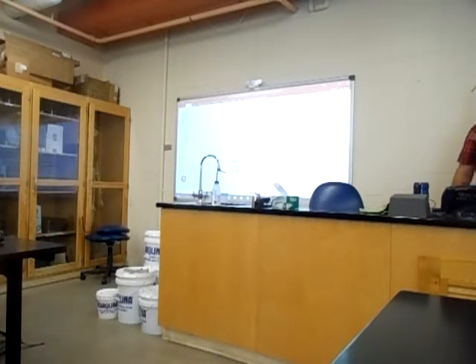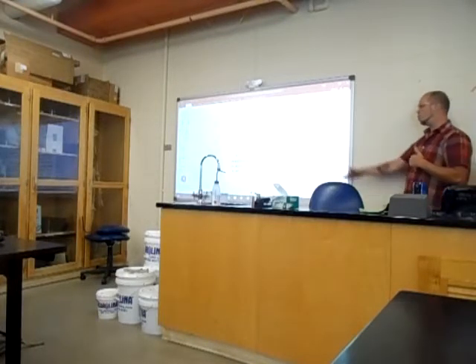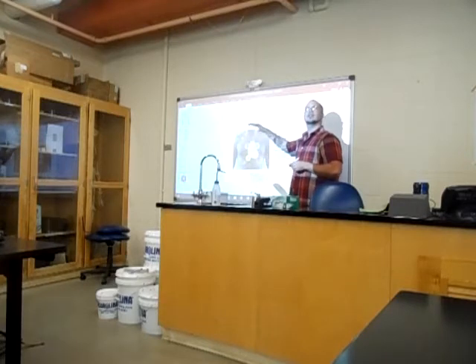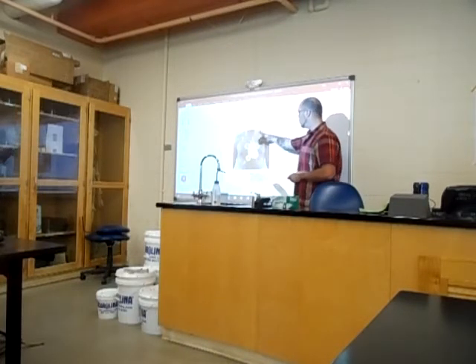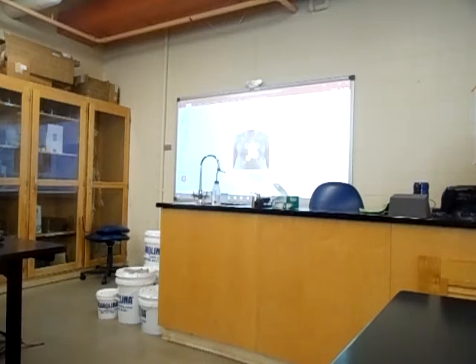So say you're listening to a person's heart and you hear a murmur, you hear an abnormal sound, you may want to try and figure out which valve is affected, right? So there are actually different points on the person's chest where you can place a stethoscope, or your ear if you're old school, to hear different valves more clearly, okay? So you see over here, there's the auscultation point for the aortic valve, for the pulmonary valve, for the tricuspid valve, and for the mitral valve. And using that, you can hear each of the valves more accurately.